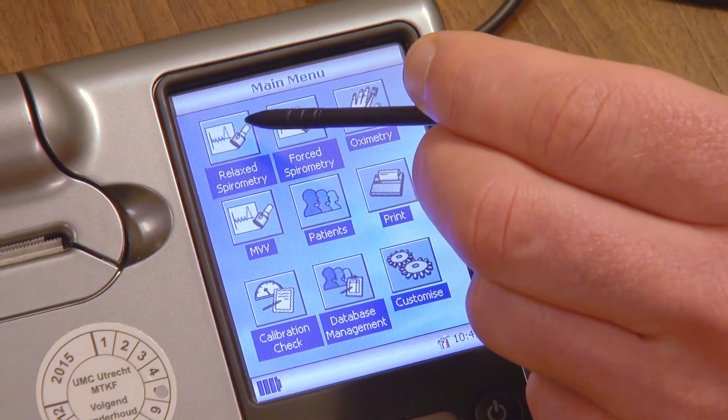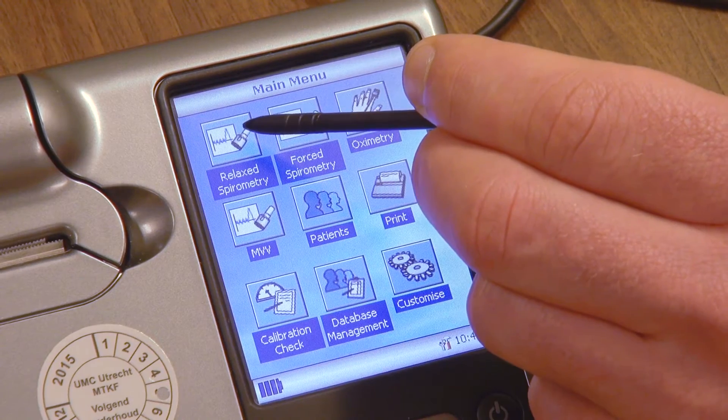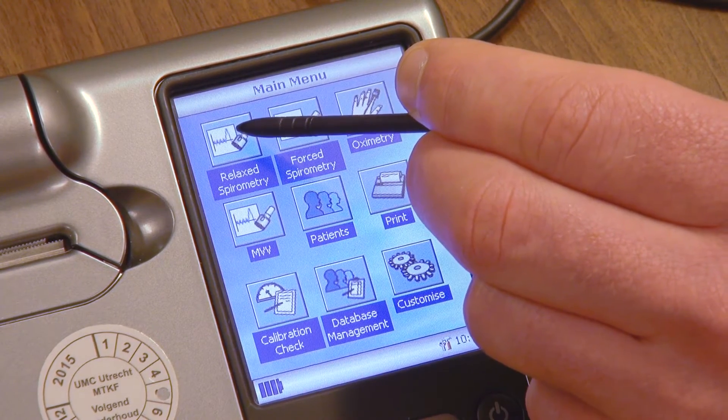Select the test you would like to perform: SVC, shown as relaxed spirometry.